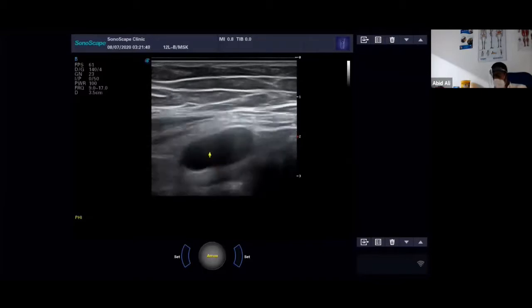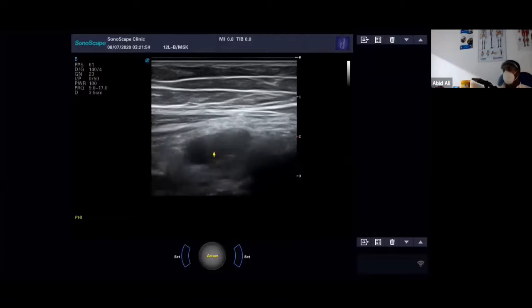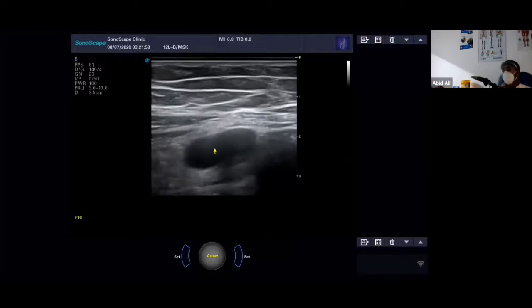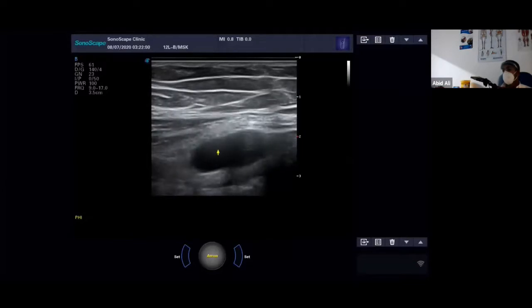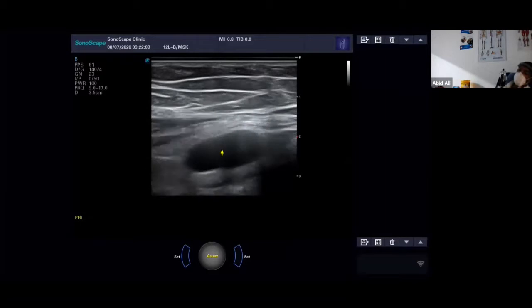But you have to be really careful with lumps and bumps. I think we're going to talk about lumps and bumps at some point, but you have to be really careful because they do cross over, and things can look benign and be malignant, and things can look malignant and be benign. So you just have to follow a few schools of thought. Just look at the outline. Is it a smooth outline?